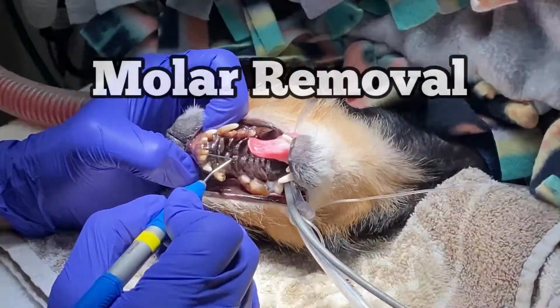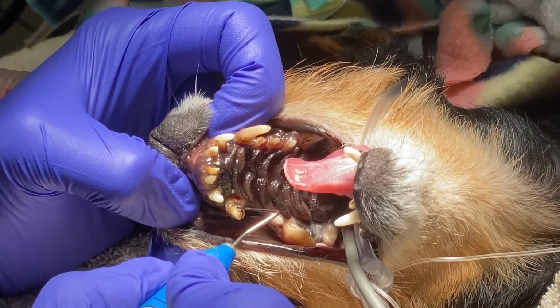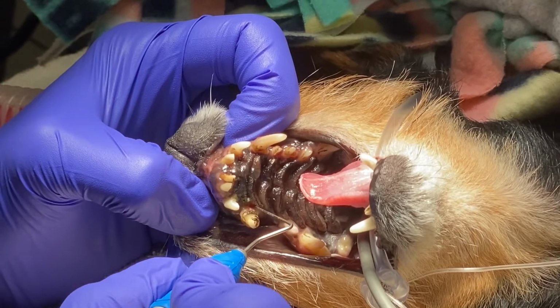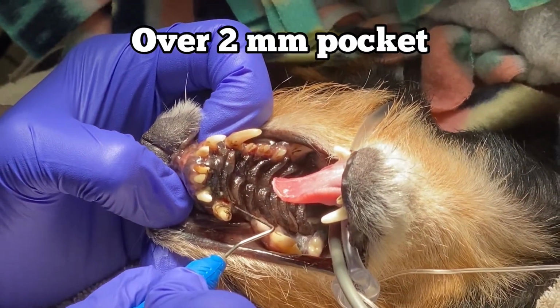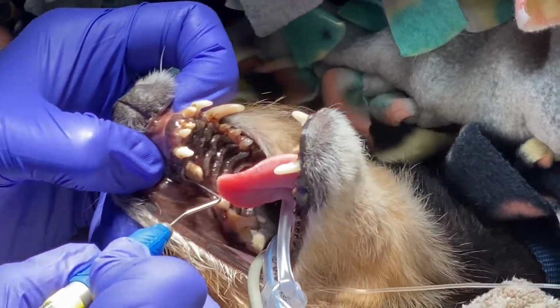So you can see we've got multiple teeth that are missing or diseased. We've got a canine tooth here that has a mobility that you're not supposed to have in a canine tooth. We also have very deep pockets around there. Anything over a 2 millimeter pocket in a dog's mouth is abnormal. So you can actually see I can drop that probe all the way up to 6 millimeters around.